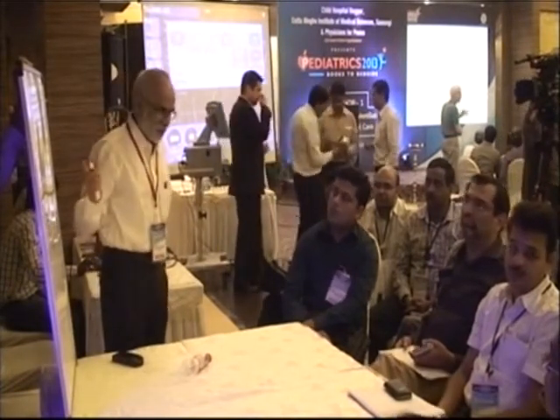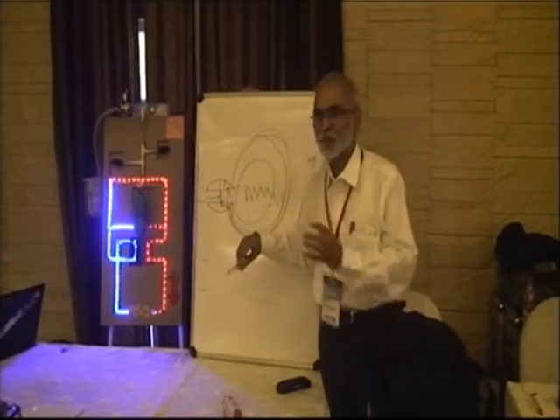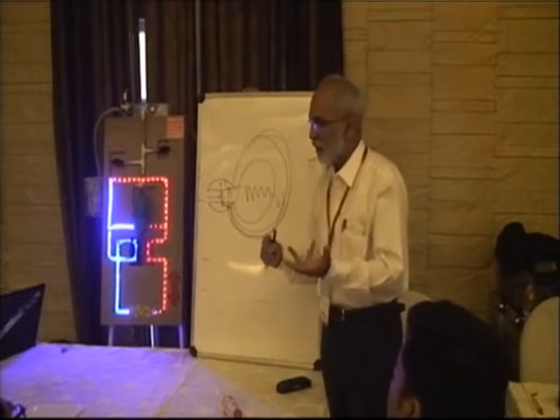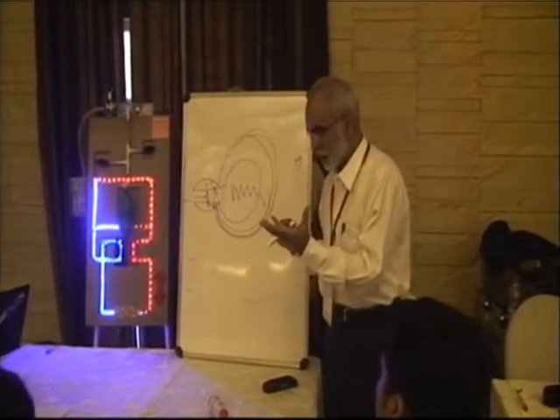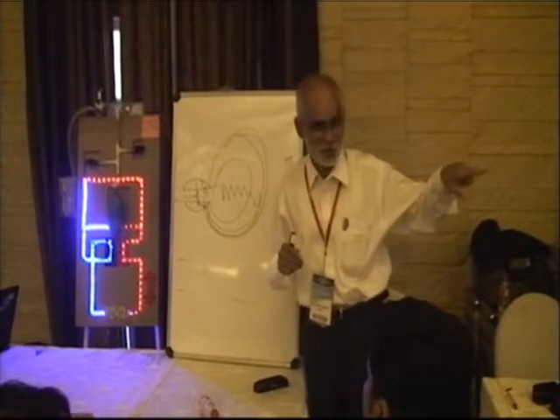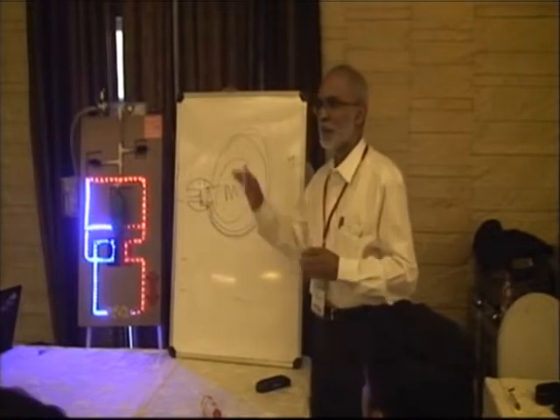Now, just to simulate this further, I'll show you the working heart model tomorrow, which will be at the center of this model, to simulate the circulation. But the next thing that should accompany this model is, you may ask me, you don't paralyze every person. So this model doesn't represent that, but we are developing a lung over this lung. That lung will ultimately have a vacuum created, like an intrapleural pressure, and when the vacuum gets created, this lung will expand. So it will simulate a normally breathing lung. We are going to use a syringe with a driving pump to do this, like the kind of simulator which you see there. At the moment we are not able to do it.